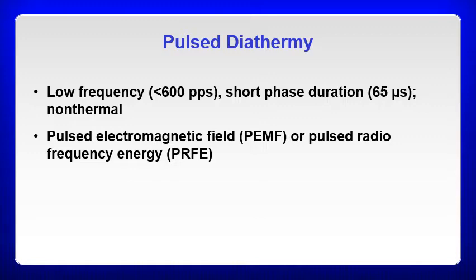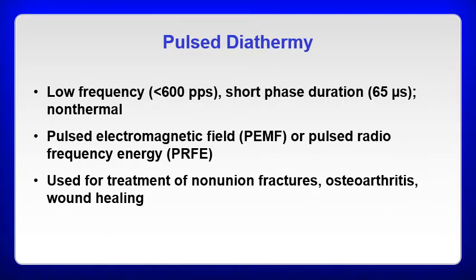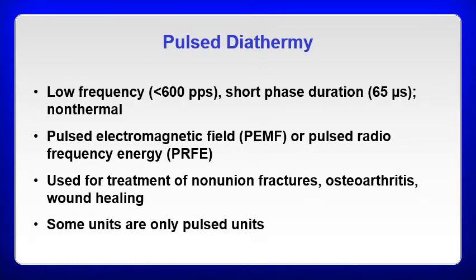And again, just so that you see some of the different names utilized for this: pulsed electromagnetic field or pulse radio frequency energy. These are just other terminology utilized to describe this. Again, talking about the different uses, it has been used in the treatment of non-union fractures, osteoarthritis, and wound healing.